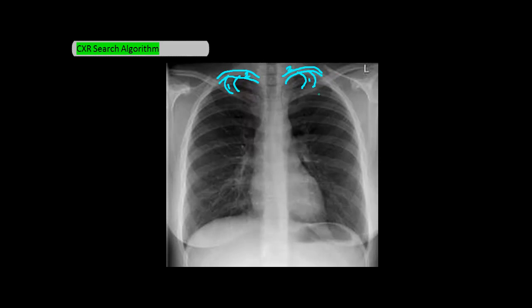From there it gets pretty easy. Continuing the count: three, four, five, six, seven, eight, nine, ten, eleven, twelve — and that's how you count ribs, drawing a line through the middle of each rib as you go.